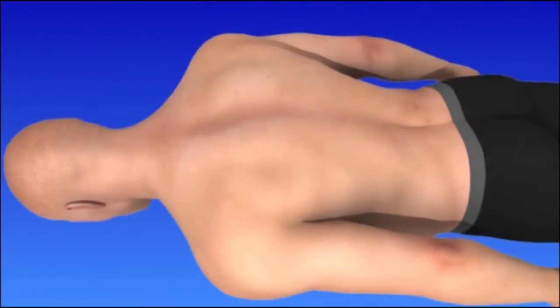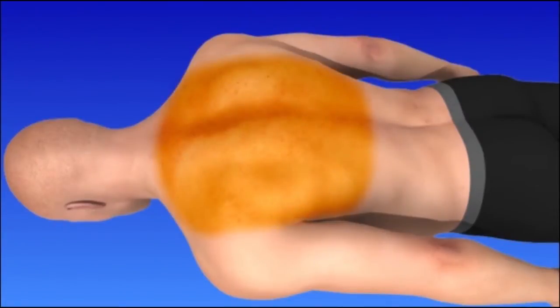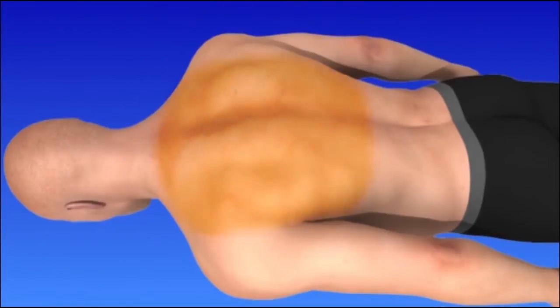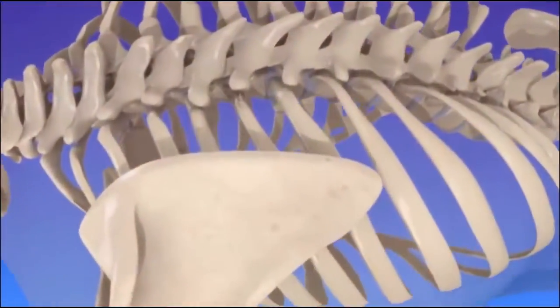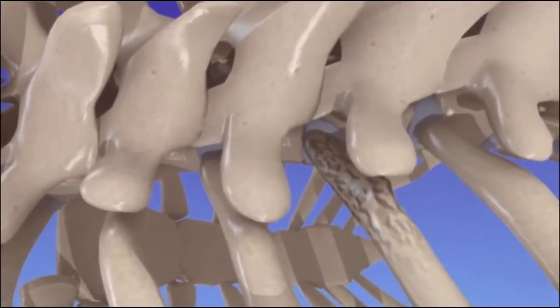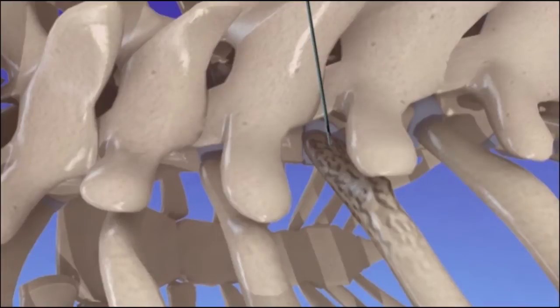To begin the outpatient procedure, you will be positioned lying down. Your upper back area will be sterilized and numbed with an anesthetic. You will also receive a relaxing medication before the start of your procedure. Your doctor will then use a live x-ray to carefully insert and guide a needle to the costovertebral joint.